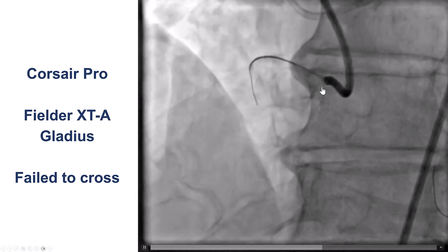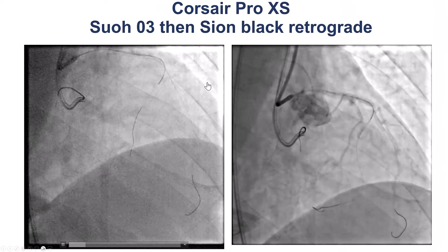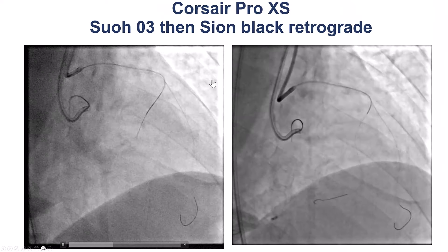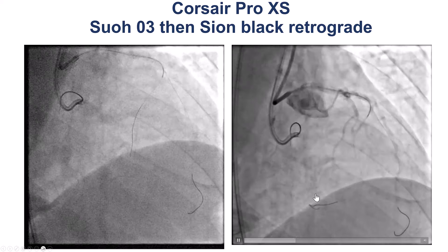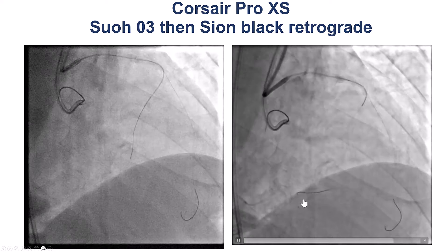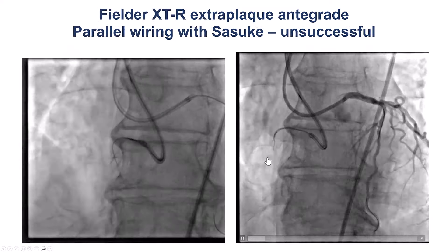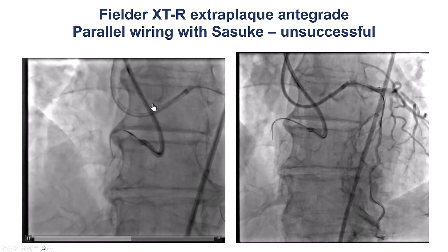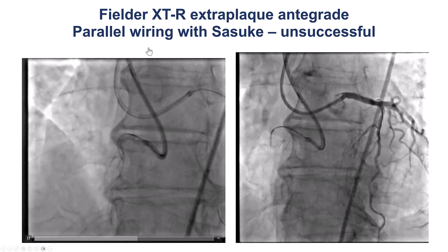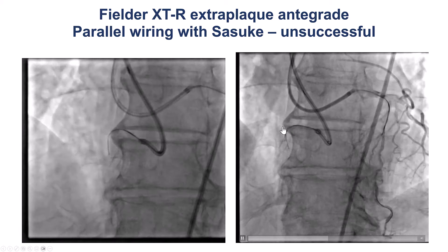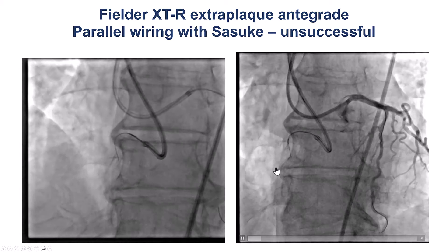We tried antegrade wiring with polymer-jacketed wires, but this was not successful. So we switched to the retrograde approach. Despite trying a SU-03 as well as a Sion Black guidewire, we were actually unable to cross distally. We did have a safety wire into the LAD for protection. We then went back in the antegrade direction and tried parallel wiring. The wire was in the extraplaque space, but once again we did not have good luck with crossing.